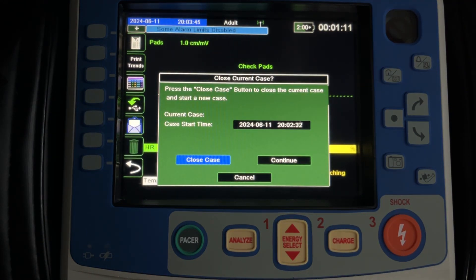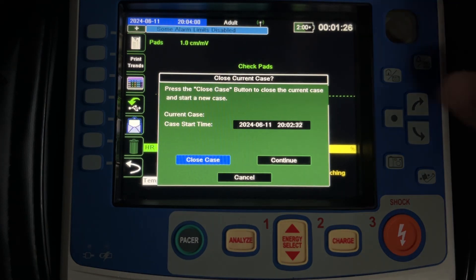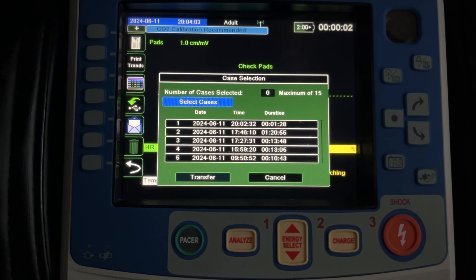It's going to prompt you to either close the case or continue. This choice will be dictated by when you're doing this. So if you're at the end of the call, you're pulling into the ambulance bay at the hospital, and you say you're pretty much done treating this patient and nothing crazy is going to happen, you can hit Close Case. That will manually close the file for that particular patient and make it available to upload.